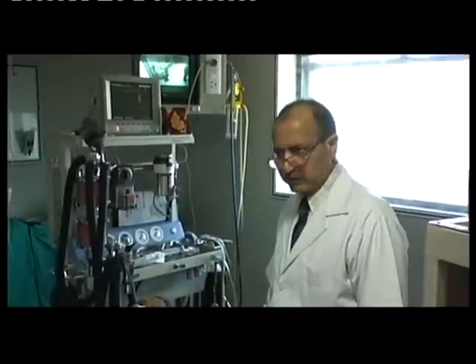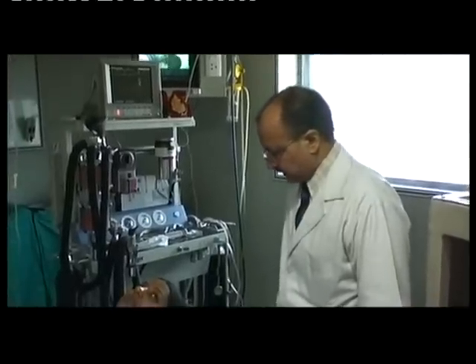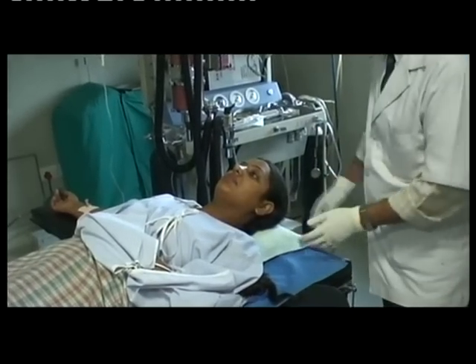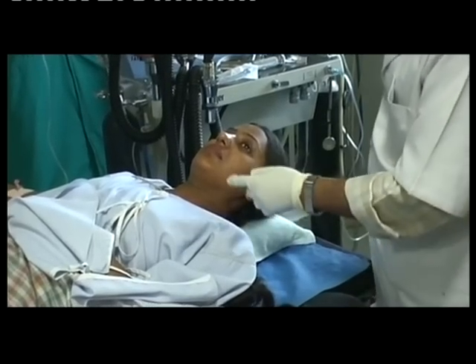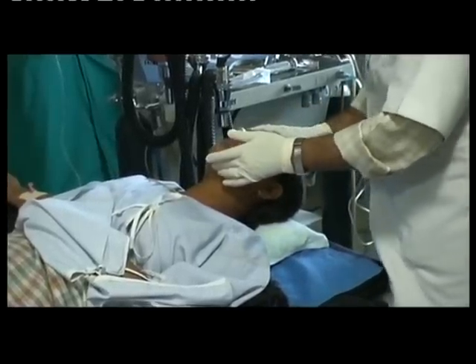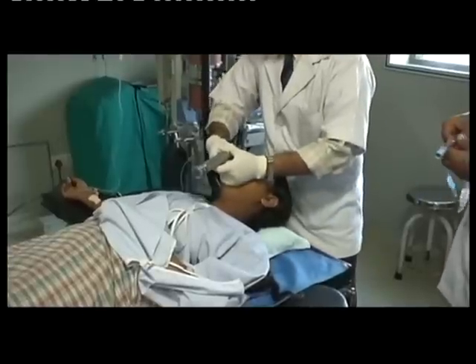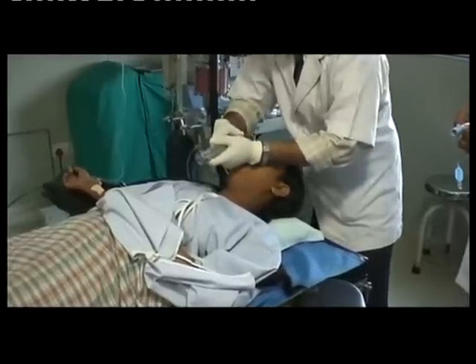The first point to take care of is the position of the patient. The optimal position for laryngoscopy is flexion of the lower cervical spine and extension at the atlanto-occipital joint. The flexion of the lower cervical spine is maintained by placing the hand under the head like this. The second point is that traction should be applied in the line of the handle at right angles to the blade, to avoid injury to the teeth.